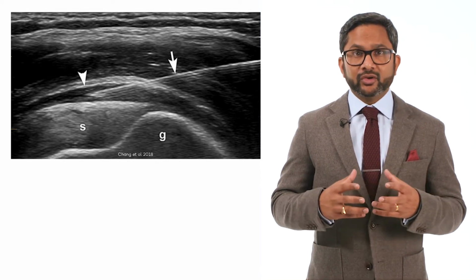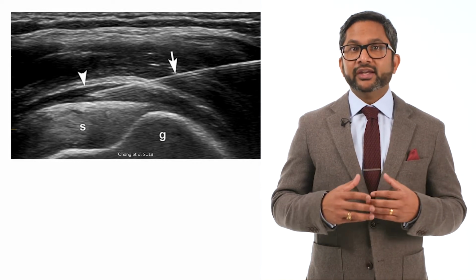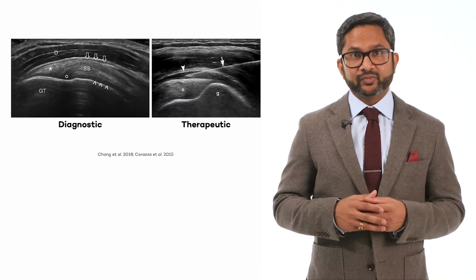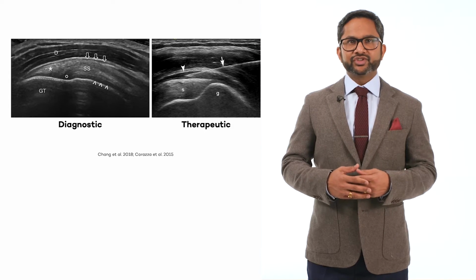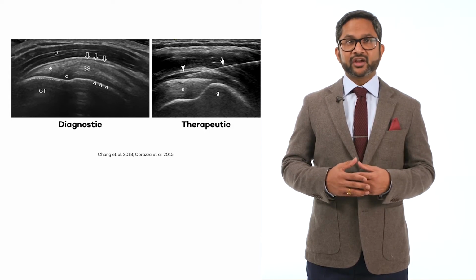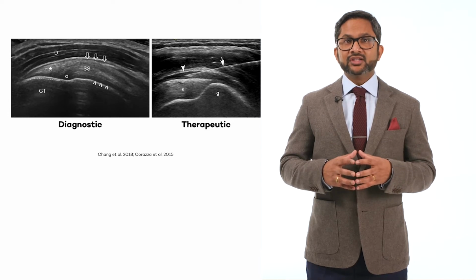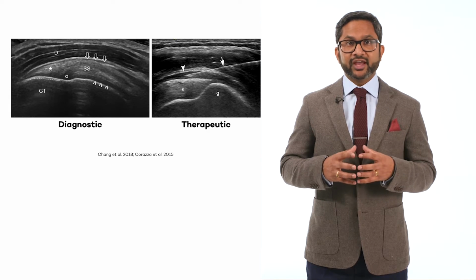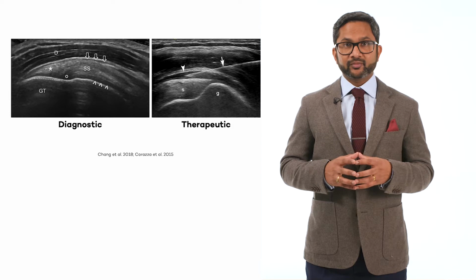Depending on target localization, clinicians can easily select the technique of needle insertion and therefore avoid injury to nearby structures. It is important to consider that ultrasound guidance for injection should not be considered as precise targeting alone. It offers comprehensive guidance for the treatment process, starting with clinical decision making, as intervention could be diagnostic, therapeutic, or sometimes both diagnostic and therapeutic.